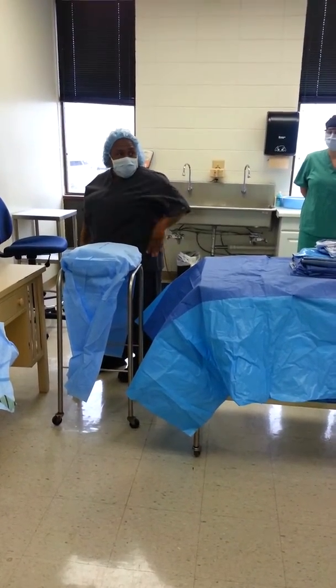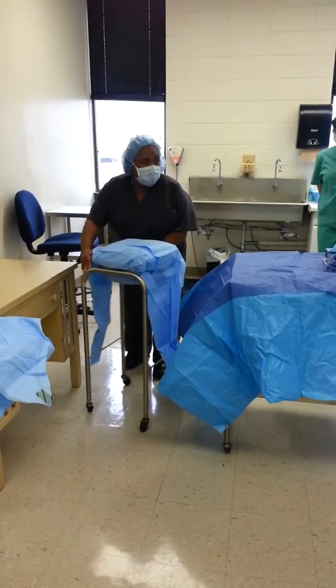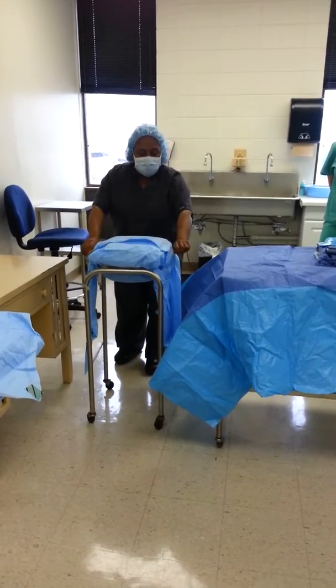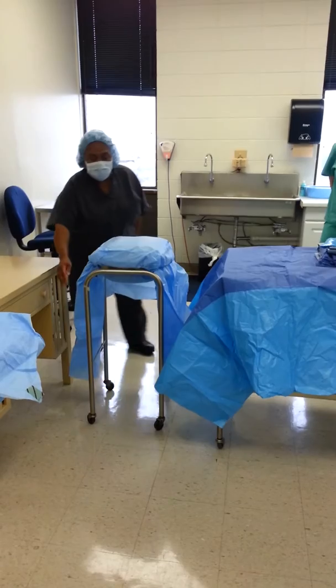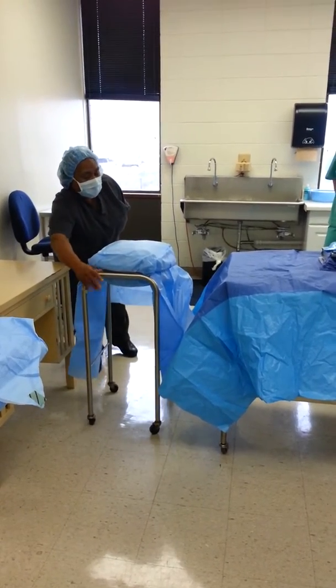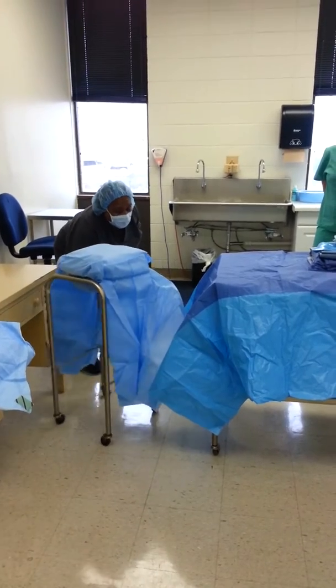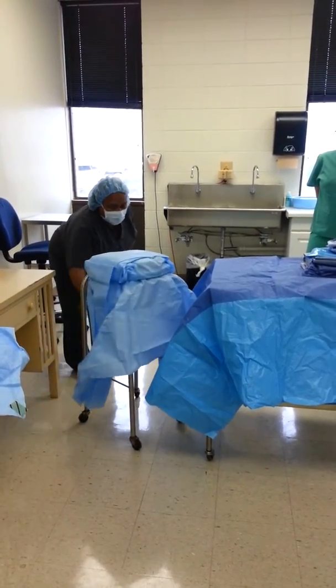Now, because it goes to the side, and you're looking, I can't walk here, because then my back is to a sterile field. So I have to turn so that the opening is to me. So then I pull on the side, and I pull down, and this is double wrap. Then I reach around to the metal part of the stand, or I can go to the leg part, which is below tabletop, right? And turn it.